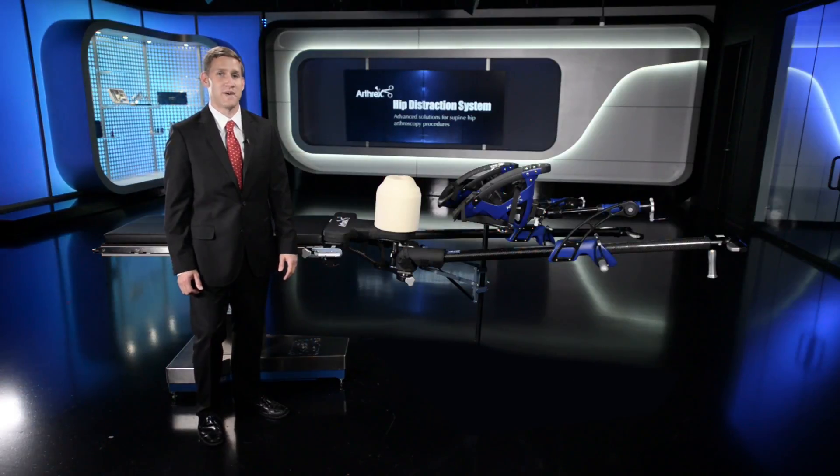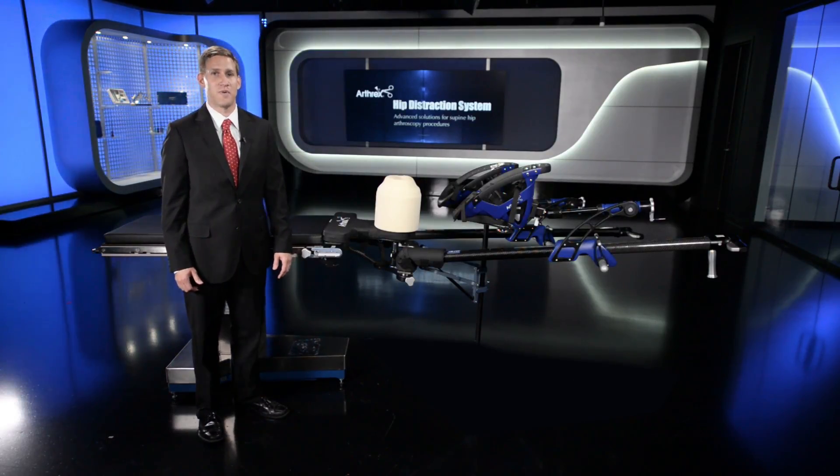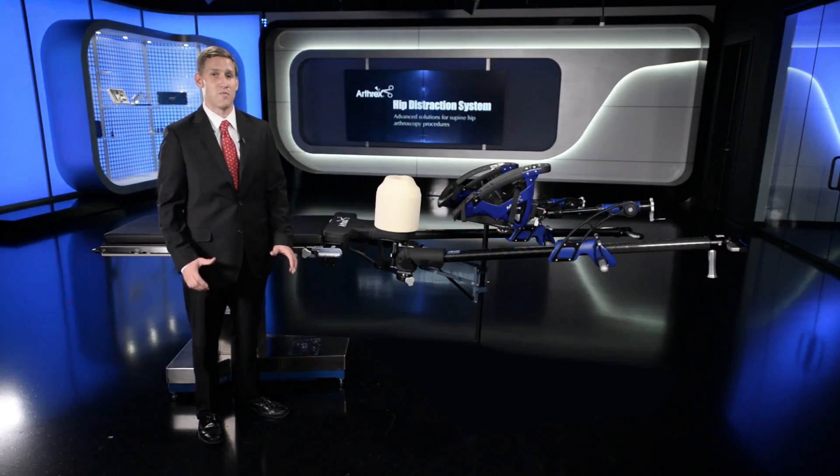Today I'm here to present to you the features and benefits of the Arthrex hip distraction system, the most advanced supine positioning table attachment available on the market.